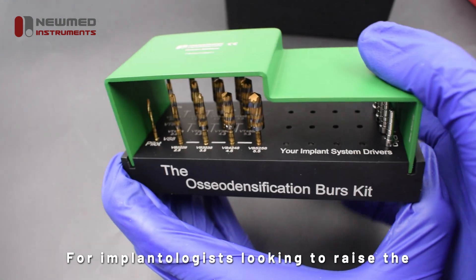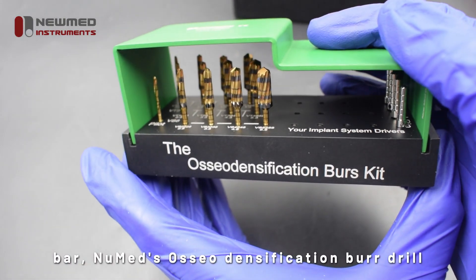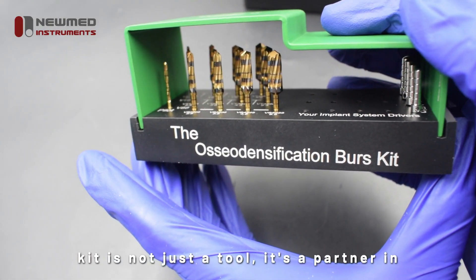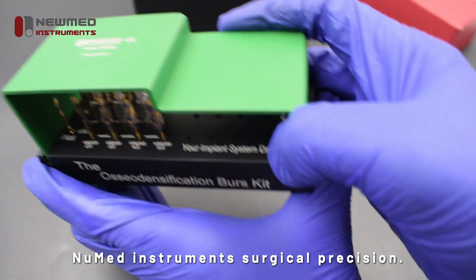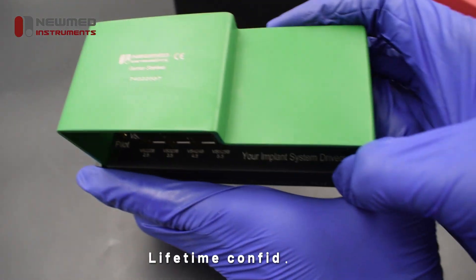For implantologists looking to raise the bar, NuMed's osseodensification burr drill kit is not just a tool — it's a partner in excellence. NuMed Instruments: Surgical Precision. Lifetime Confidence.